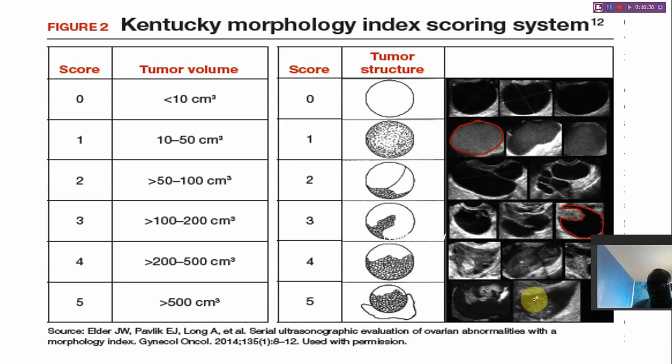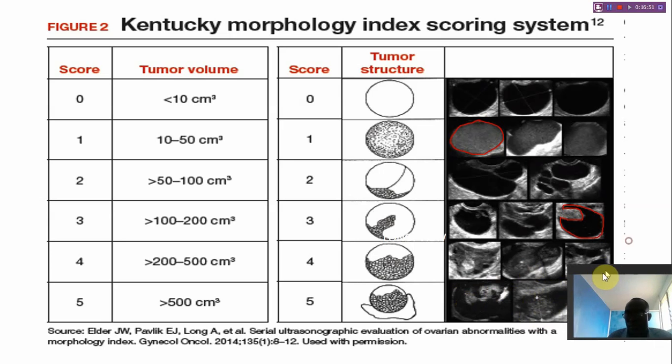So here this is a dermoid. A dermoid is a teeth-like or hair-like structure in the ovary that produces posterior acoustic shadow. You can see other fluid around it. So this is a typical example of a dermoid cyst.